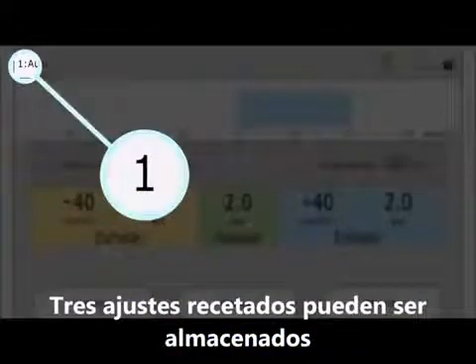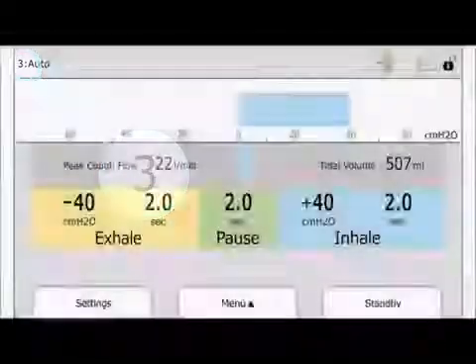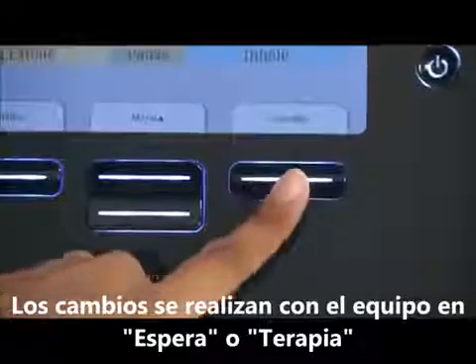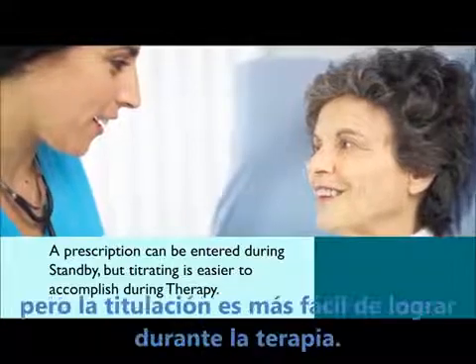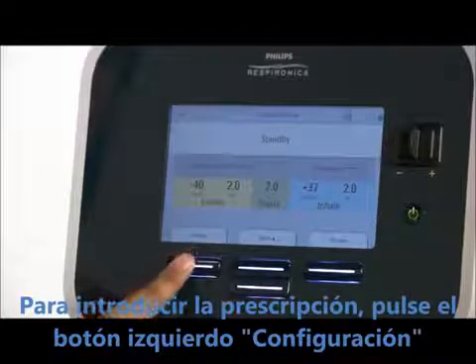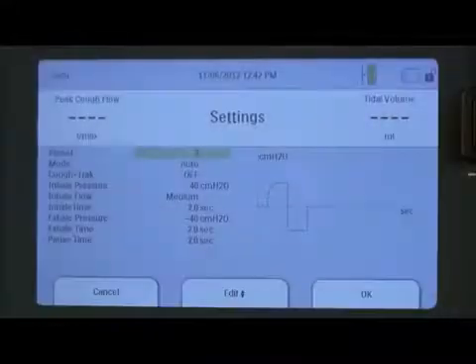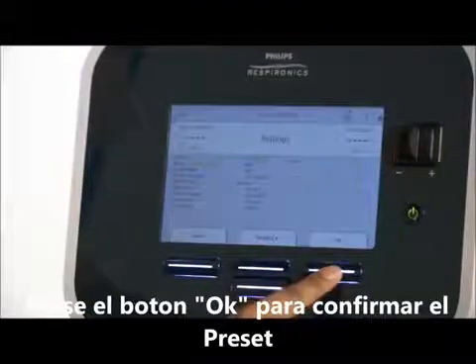Three unique prescription settings can be stored in CoughAssist T70, so you can quickly select treatment pressures based on a patient's current needs. On the upper right-hand side of the screen, if you see a small open lock icon, you will be able to make changes to the settings. Changes can be made during standby or therapy. A specific prescription can be entered during standby, but titrating is easier to accomplish during therapy. To enter prescribed settings, press the left button under settings — a settings menu will appear. The first item on the list will be highlighted; in this case, preset. Press the modify button, select which one of the three presets you wish to modify, then press OK to confirm the preset.